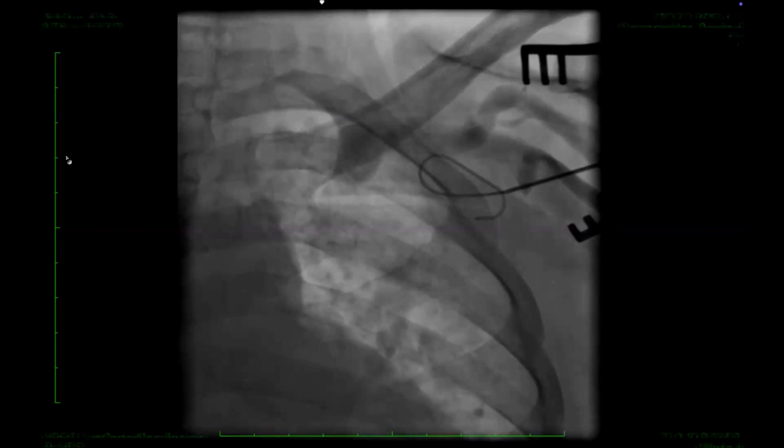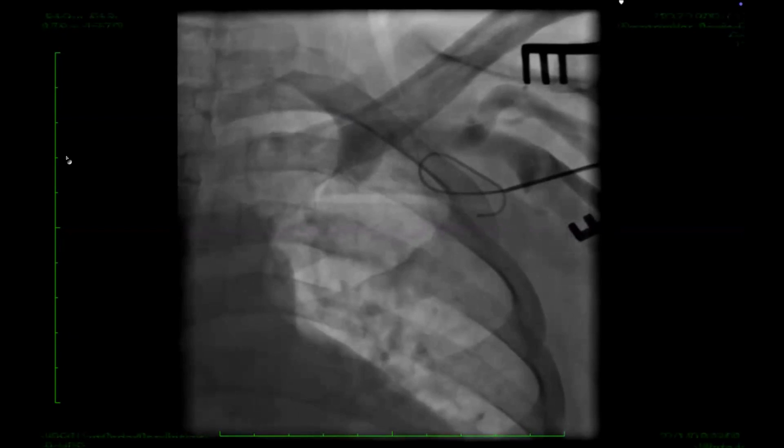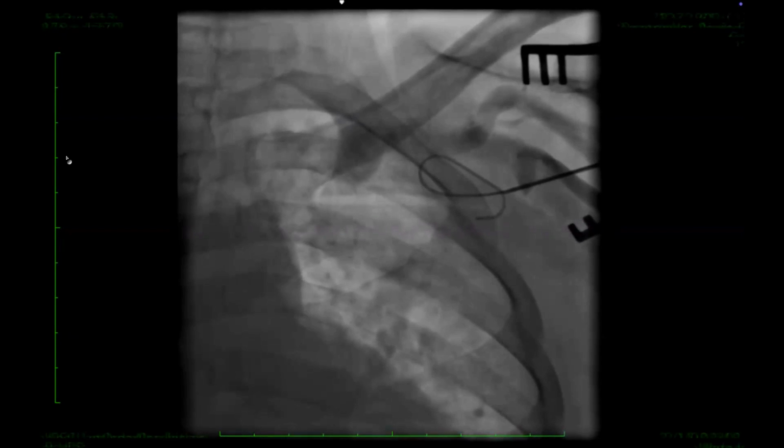I haven't actually pre-selected these. This is just a bunch of CRTs from the last few weeks that I'm sharing.